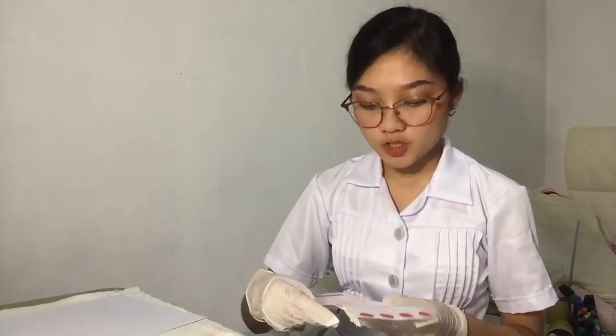And also, kapag may layering or may mga problems in dropping the blood, or the machine may not accept it or reject yung procedure or the filter card, okay? We have to let this dry for a minimum of at least 3 hours. We have to keep it away from direct sunlight and away from other heat sources. After the blood spot has dried completely, we have to send it to the newborn screening center for the procedure and examination.